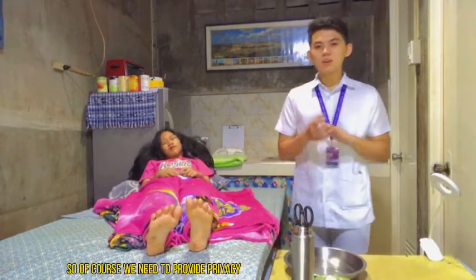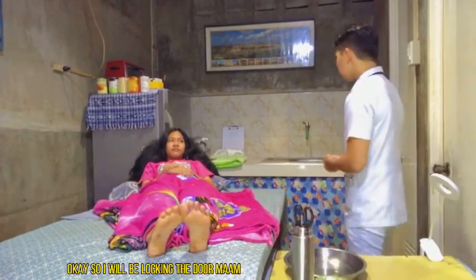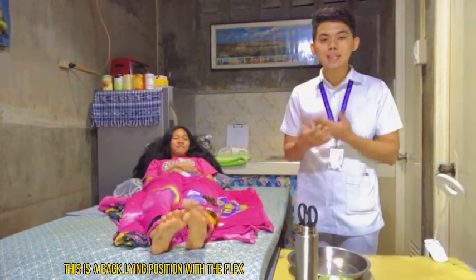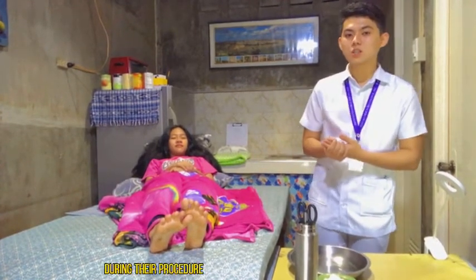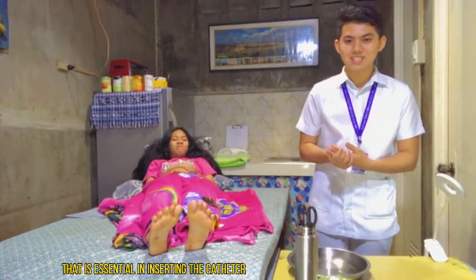Okay. So, of course, we need to provide privacy by screening or closing the room for us to respect the autonomy of our patients. Okay, so I will be locking the door, ma'am, okay? Now, position the patients in a dorsal recumbent position. And by the way, this is a back-lying position with the knees flexed and spread well apart. That will give comfort to our patients during the procedure. Also, this position will provide us a good visualization that is essential in inserting the catheter.